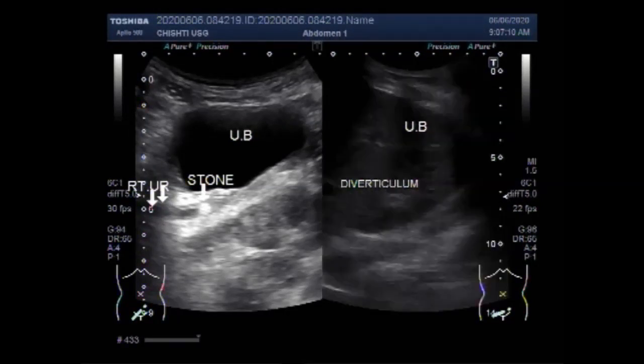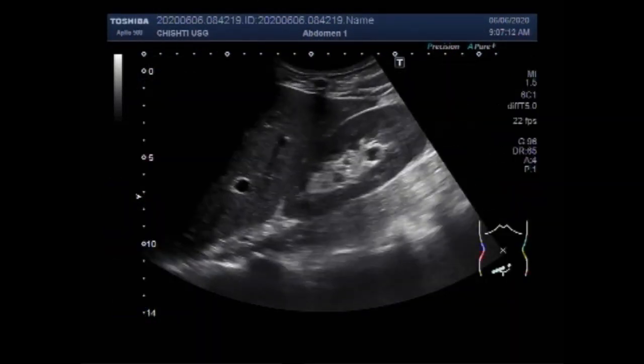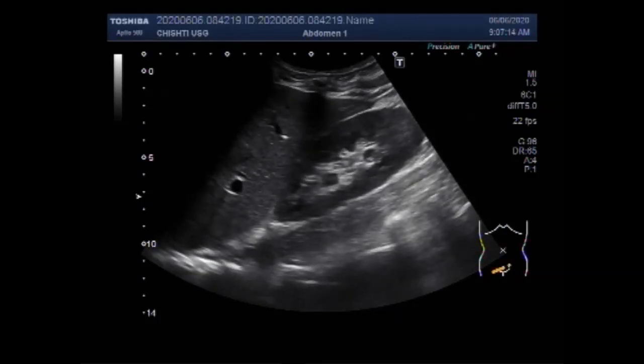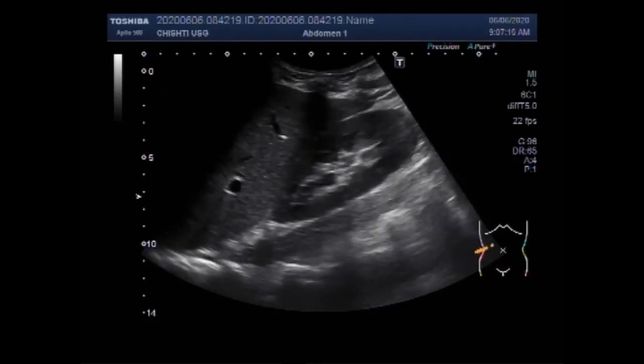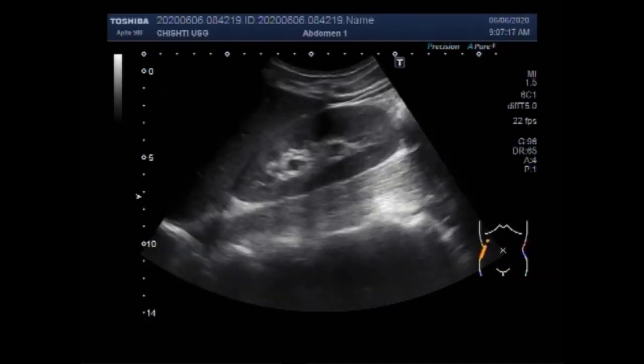Dear viewers, I hope you are all fine. This ultrasound video shows a stone in the ureter and diverticulum of the urinary bladder.